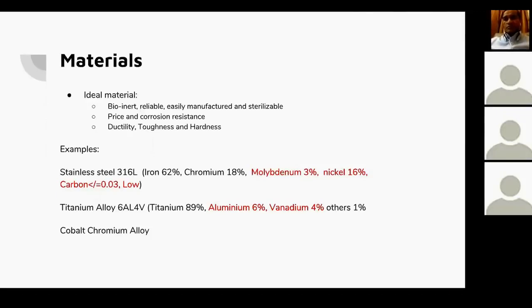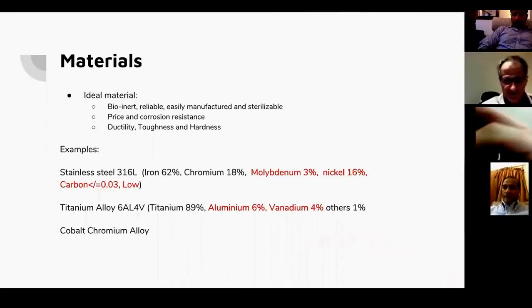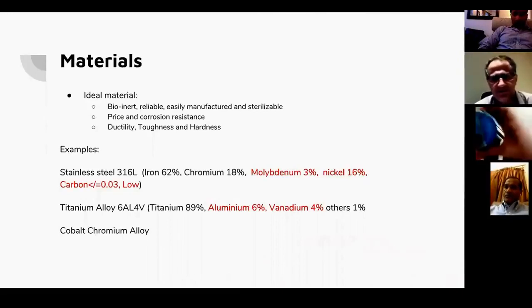The other advantage with titanium is that its Young's modulus of elasticity is closer to bone, and therefore it's more ductile, and also works better in terms of giving you working length and things like that. However, in the conversation about the pros and cons, you can say stainless steel has many ways of modifying its modulus of elasticity, and we'll come to those questions later. The advantage of stainless steel is it's cheap, it's readily available, we know its properties, and it's consistent throughout.